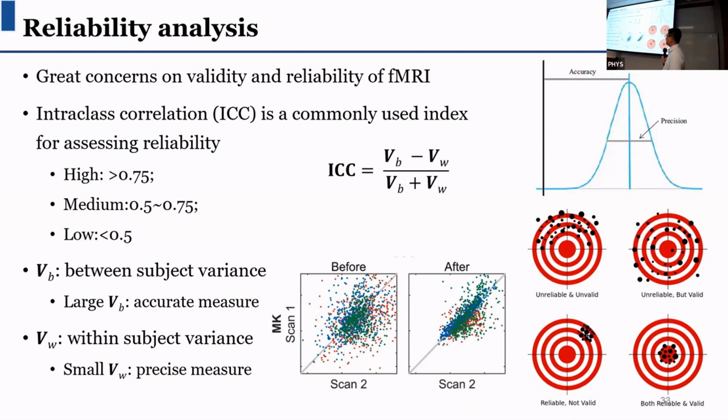These are from the same subject with the same imaging settings, yet you can see the difference between the two scans. This is what I'm saying is not reliable. But if you use deep learning to remove the scanner artifacts, then your result will be much better, as I'm showing here.